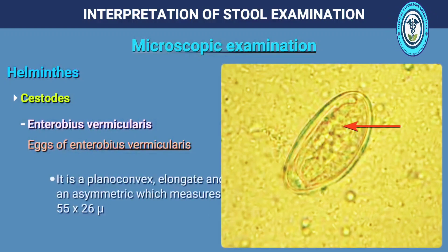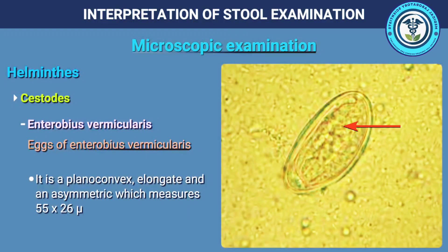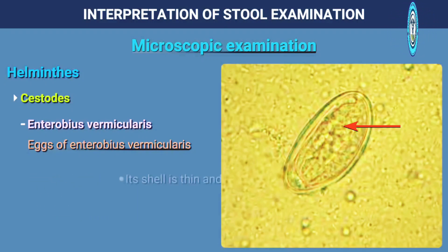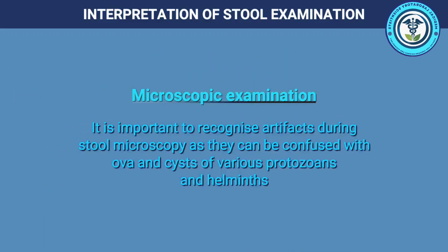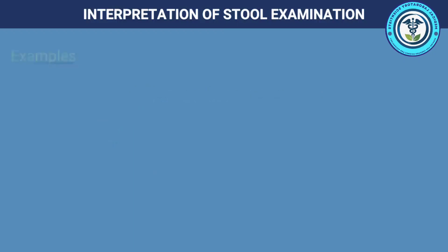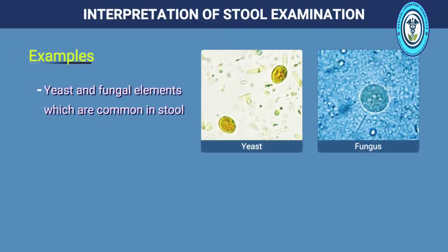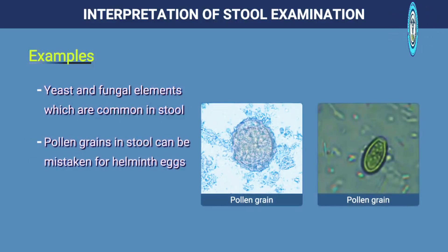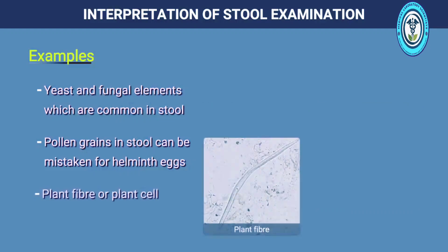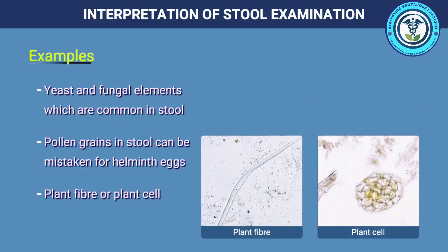Enterobius vermicularis: it is a plano-convex, elongate and asymmetric egg which measures 55 by 26 microns. Its shell is thin and smooth, and fully developed larvae are seen in the eggs. It is important to recognize artifacts during stool microscopy as they can be confused with ova and cysts of various protozoa and helminths — for example, yeast and fungal elements which are common in stool, pollen grains, plant fiber or plant cells, air bubbles, etc.